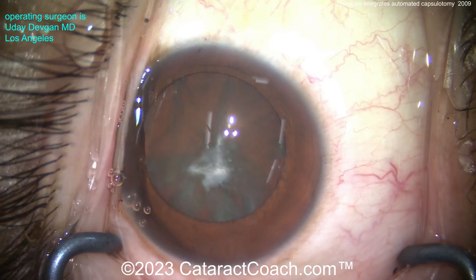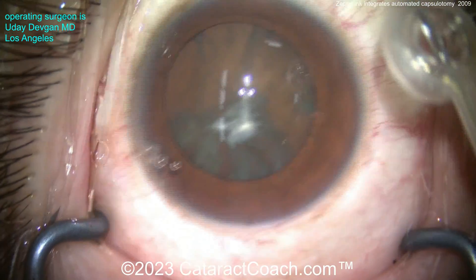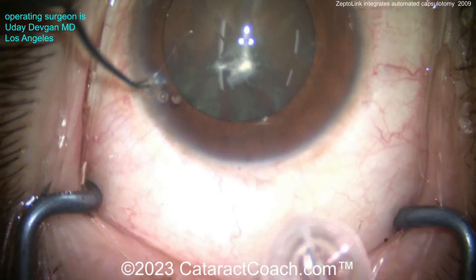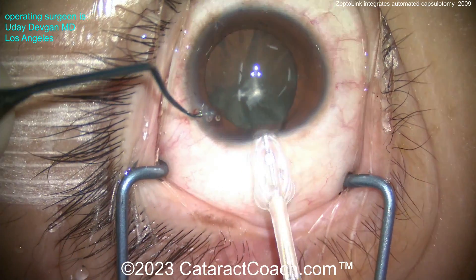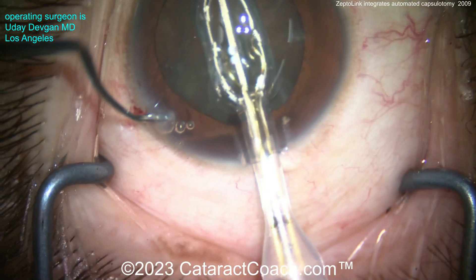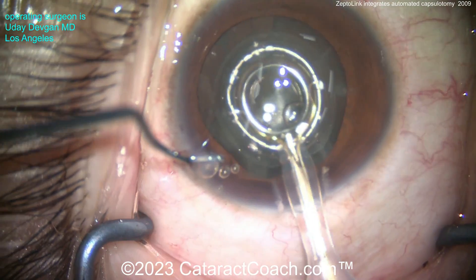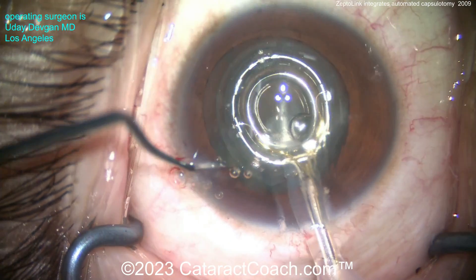So we make our incision there — a 2.2 millimeter incision made with the diamond. Now here comes the Zepto device, starting off in that 5.1 millimeter ring. We collapse it first so it can be inserted through our small incision. There it's collapsed, goes through the 2.2 millimeter incision, centering it in the eye. Now we can open up the ring — now it's round again. We center it up exactly where we want to apply vacuum.